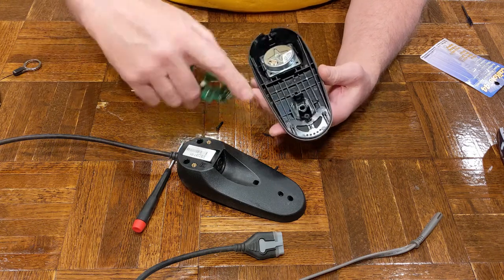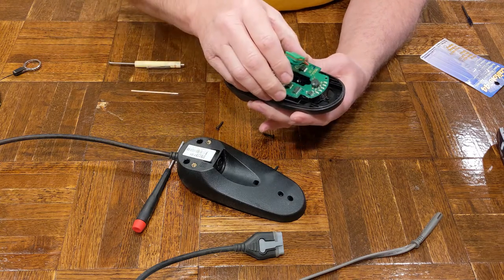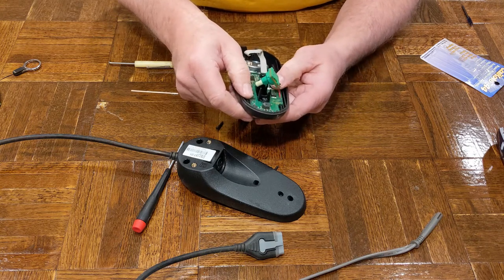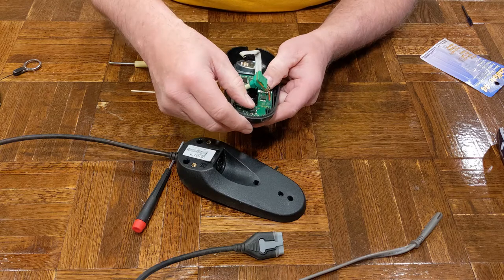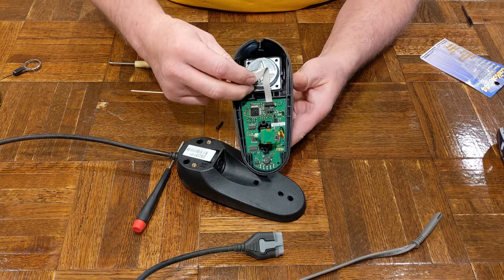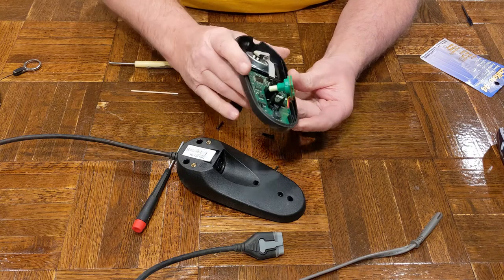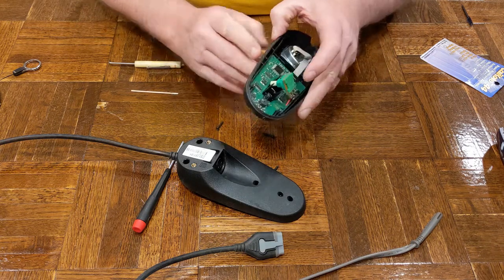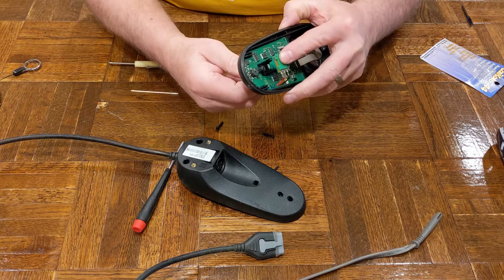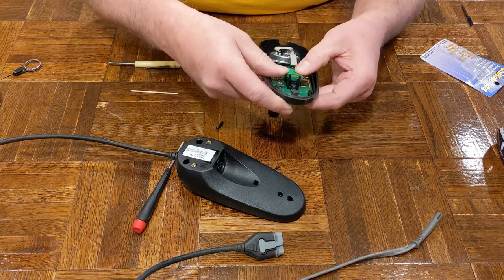After cleaning the contacts and switch pads, I decided not to apply any extra conditioner — I think it just needed to be cleaned. So I'm going to assemble it: it drops in and slides into place. The connector clicks in for the joystick, and the potentiometer for the speed control goes in. You'll have to rotate the knob to get alignment, and once it does it will click right into place.